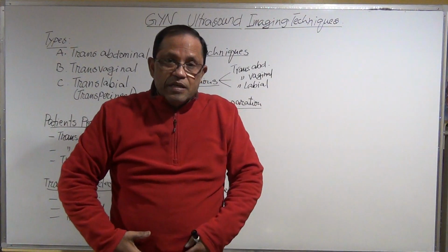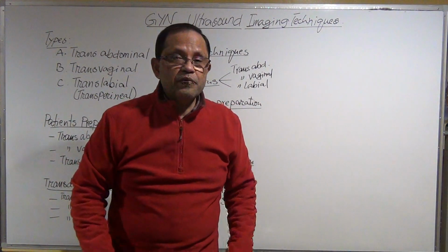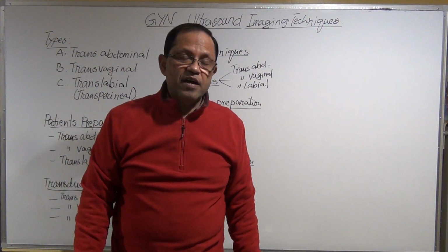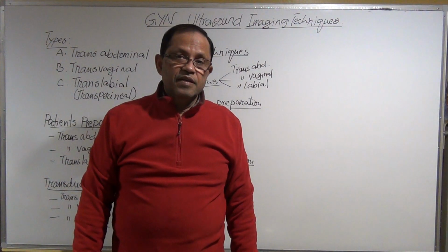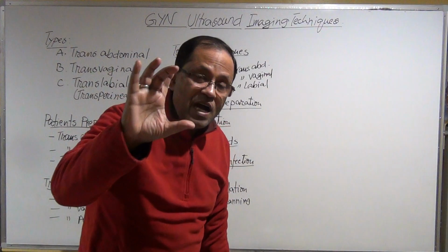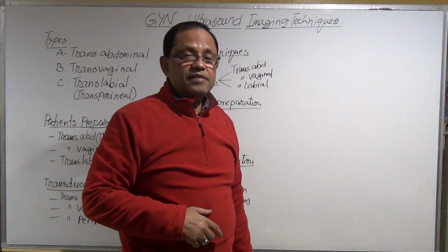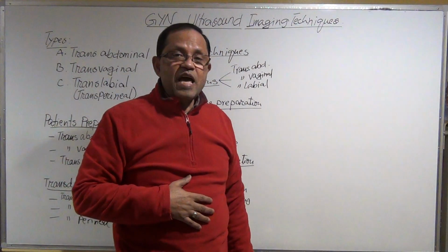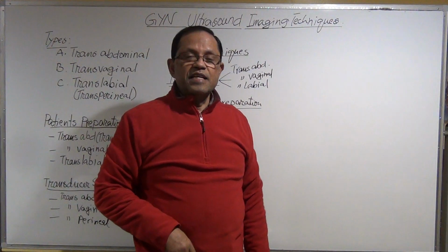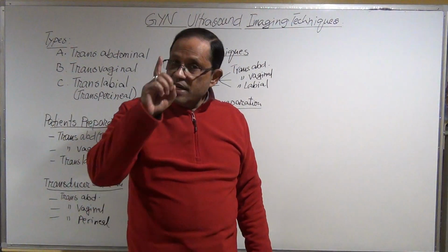It is very hard for a female to stop the urine when they pee. If you just ask them to stop, no. But if you give the cup, they will be more mentally alert. They can stop. And they will come back to you and say, now I'm relaxed, I can wait half an hour. So that is one way.